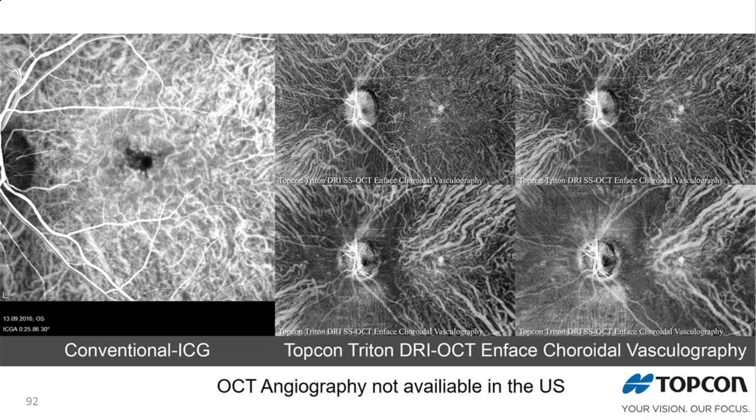Many diseases, as I was saying before, have a component in the choroid. So we've all heard of measuring pachychoroid in CSCR. But these choroidal changes also happen in systemic diseases, and they happen in other ophthalmic diseases. So we know the choroid is changing, but just measuring the choroidal thickness is not enough, because we need to know what is changing.